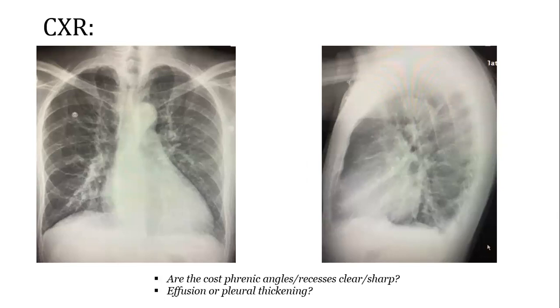And from the chest X-ray, this is what is demonstrated. On the left is the PA view, and on the right is the lateral view. But as we can see, what we can clearly demonstrate from the PA view is the prominent bronchovascular markings. And that on the right here, there is a tendency to coalescence. There is a tendency to coalescence here.